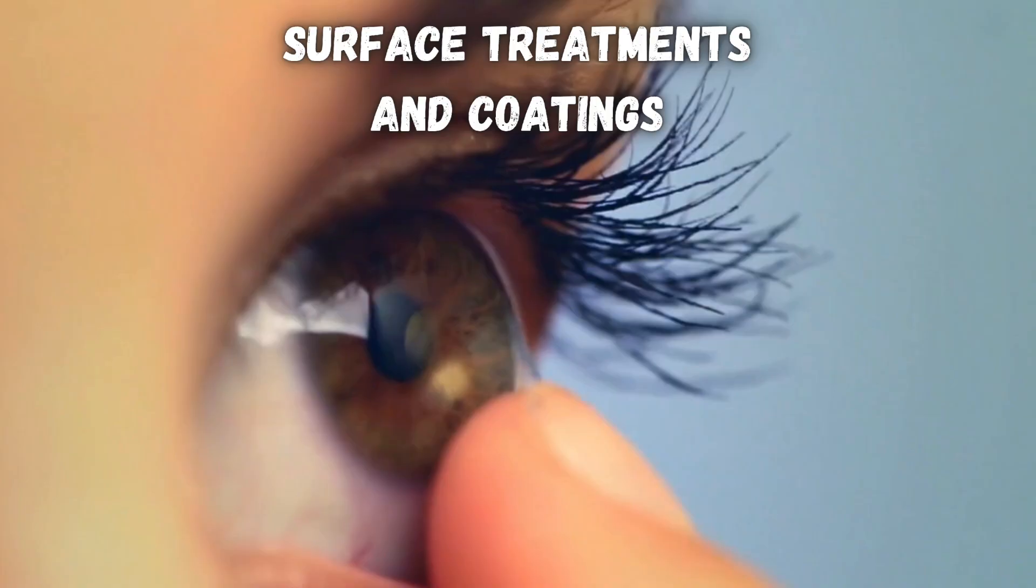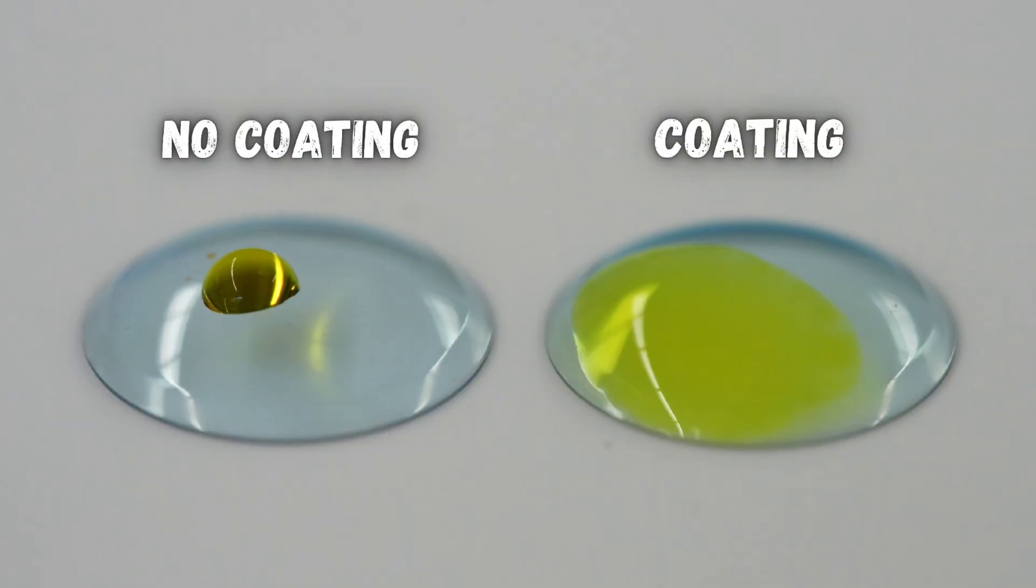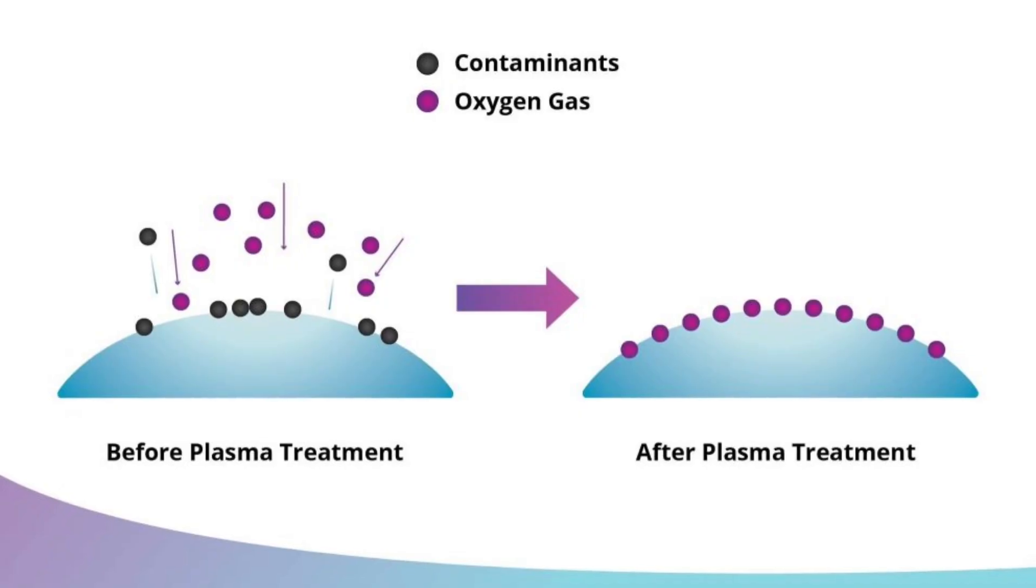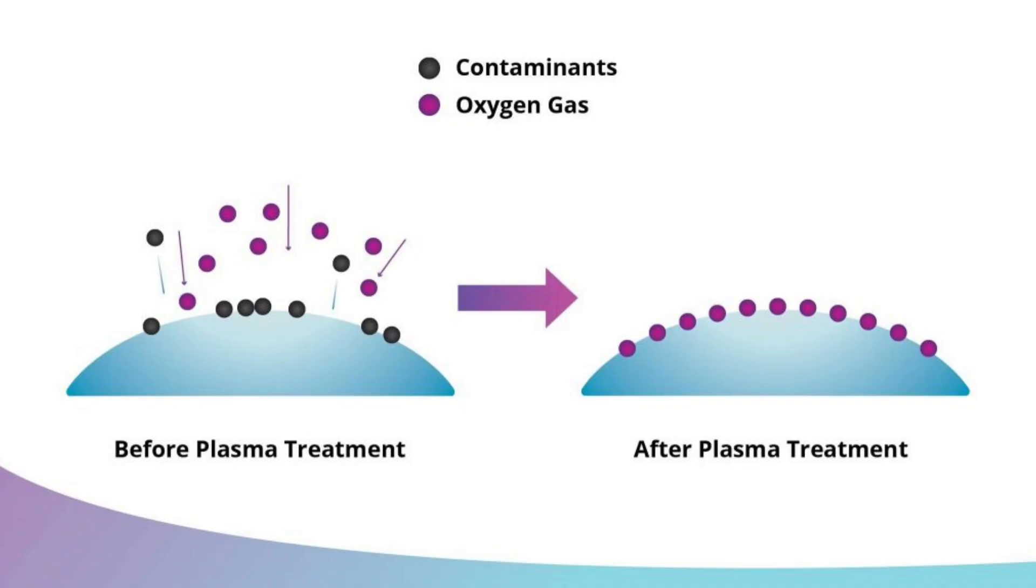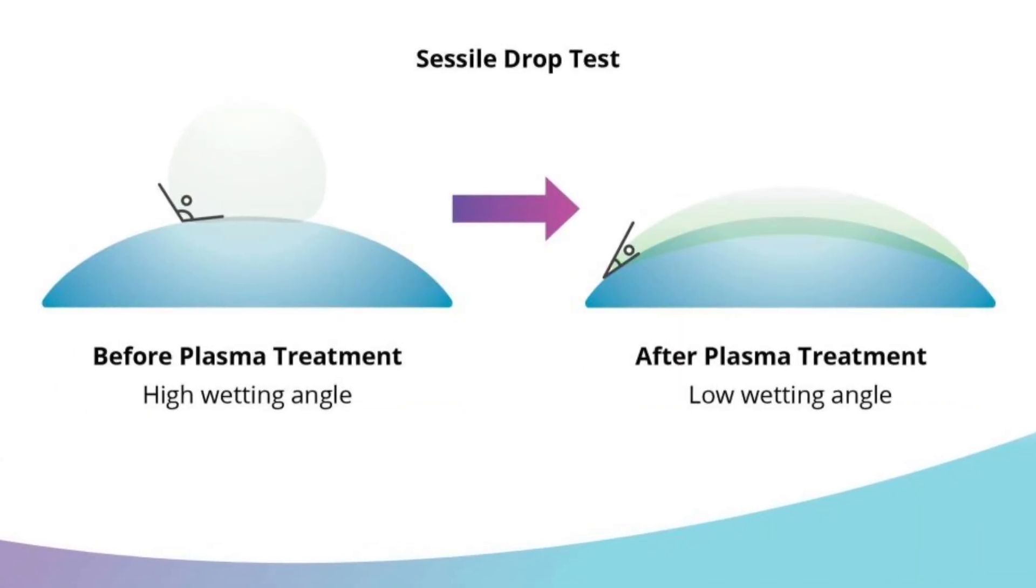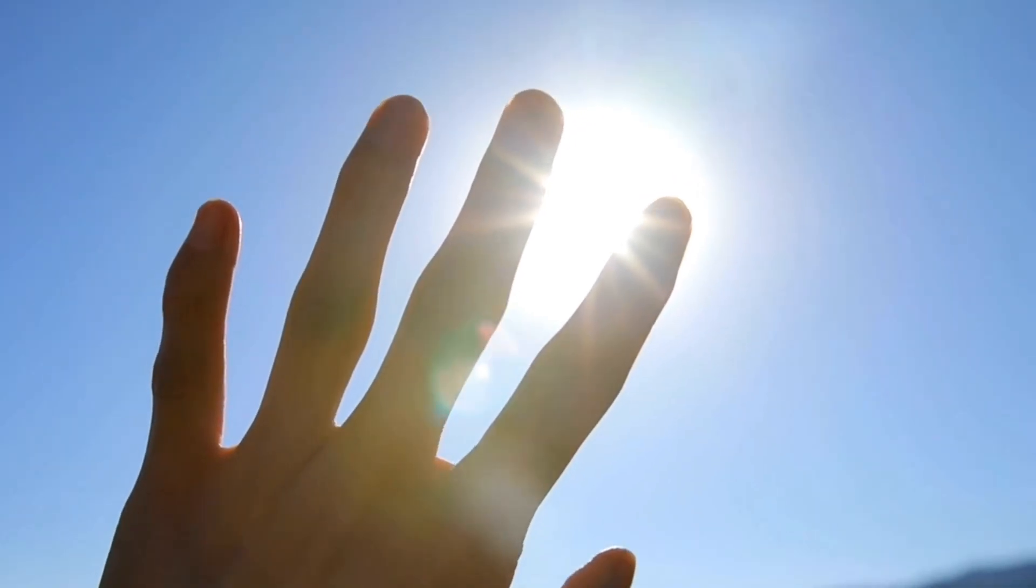Both soft and hard lenses may have surface treatments or coatings added to them, like hydrophilic coatings that improve water retention and prevent dryness, or UV blocking coatings.